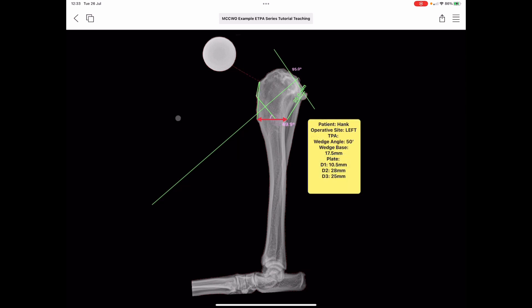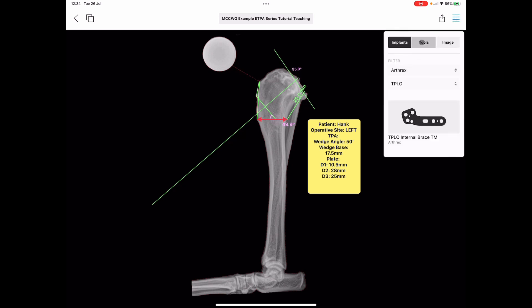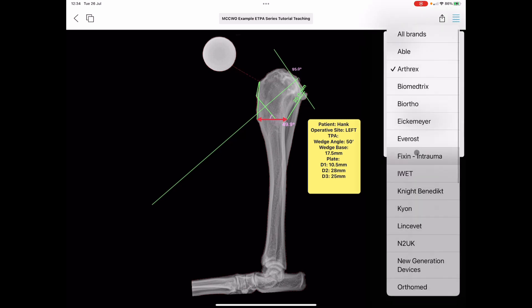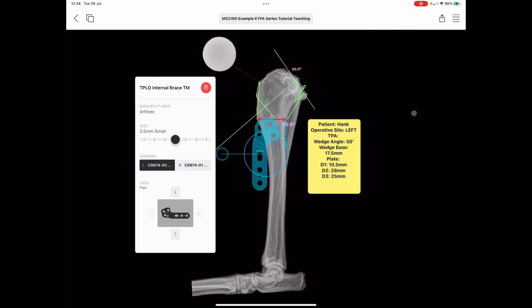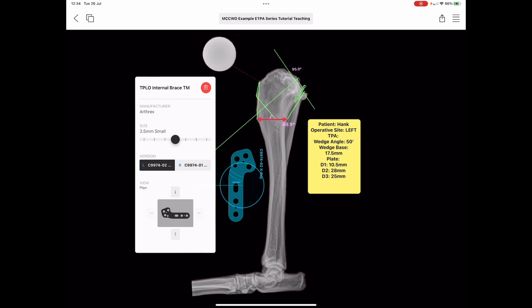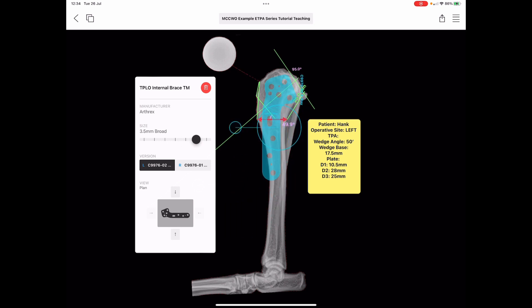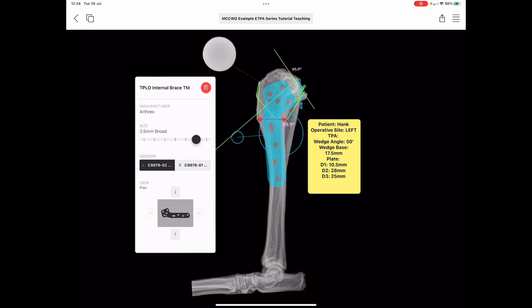We can now fill in all of those measurements using the annotations tool. A typical plan for a cranial closing wedge osteotomy will look like this. The last thing we'll need to do is template an implant to hold this all together: go to the menu top right, pick implants, choose one of the different manufacturers and the TPLO plate, then go up and down through the sizes to work out the most appropriate implant for robust fixation for our patient.